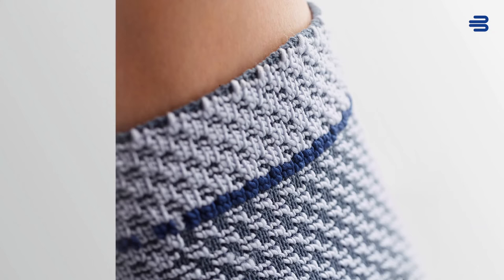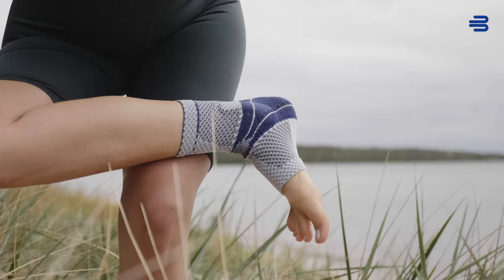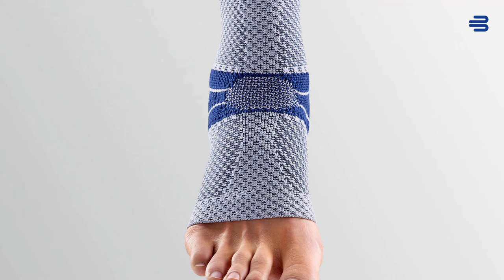Thanks to the three-dimensional flat knit technology, the breathable stretchy train knitted fabric perfectly adapts to the wearer's body shape and has many different effects. The stimulating high-low fabric also generates more grip on the skin and additionally exerts a gentle micro-massage that activates the body's own stabilization processes. A soft comfort zone prevents rubbing in the sensitive instep area.